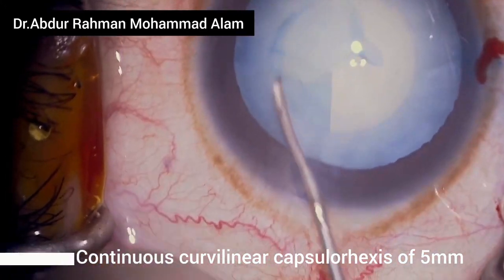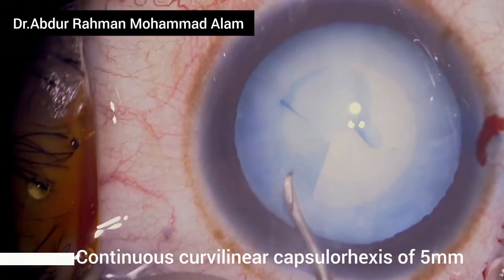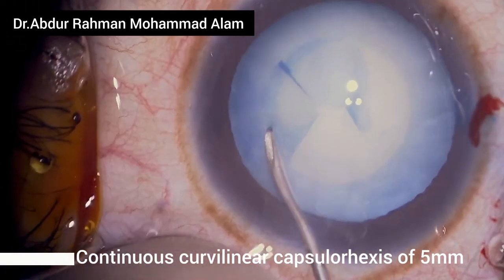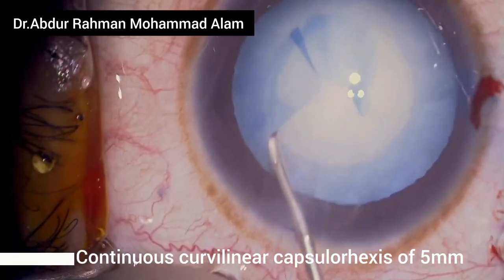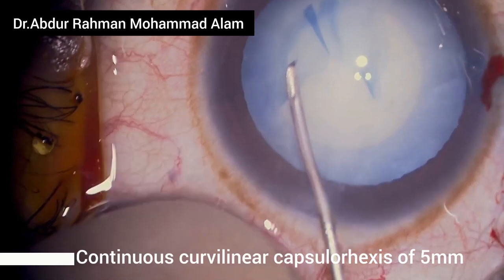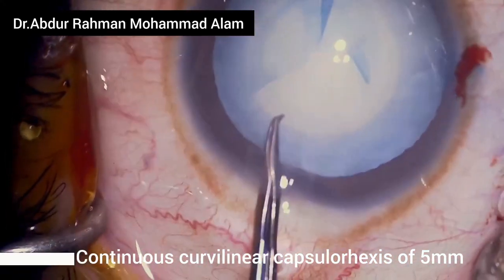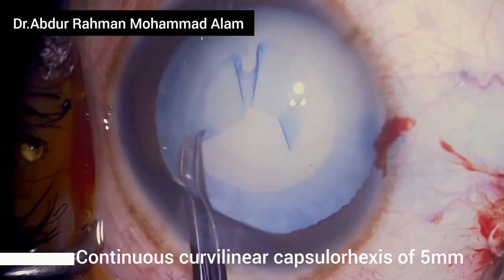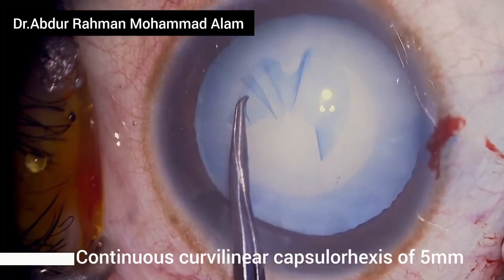Slowly I'm guiding the flap and constructing the capsulorrhexis. There is intumescent nature of the cortex — soft cortical matter underneath the capsule which is making it difficult to guide the rhexis margin with the cystotome. It is better to switch the cystotome with capsulorrhexis forceps and continue.